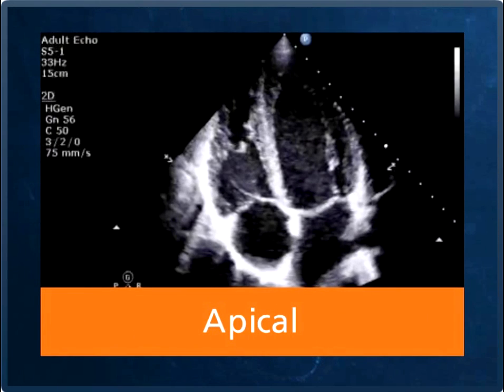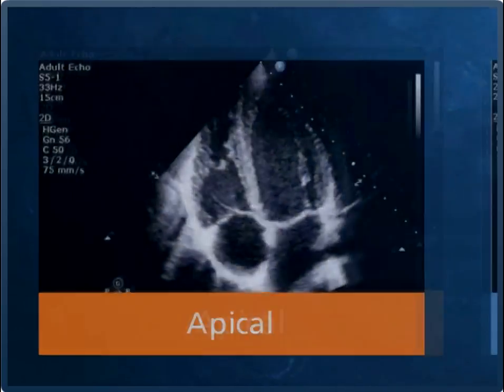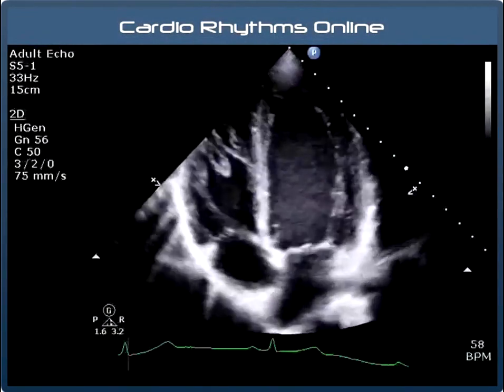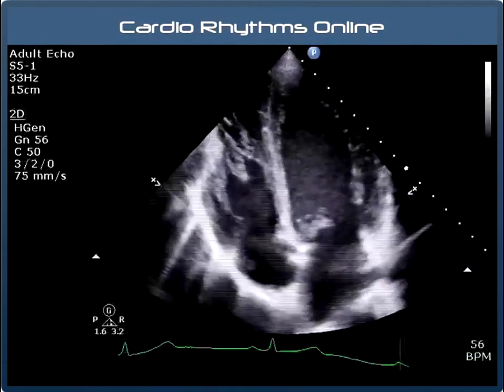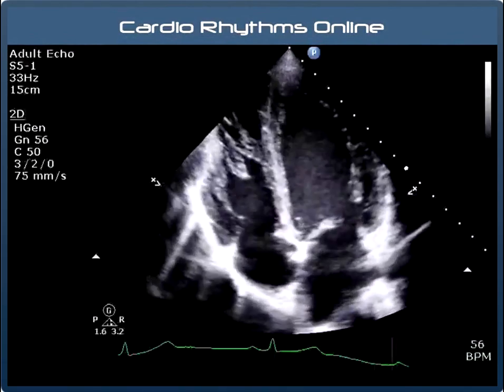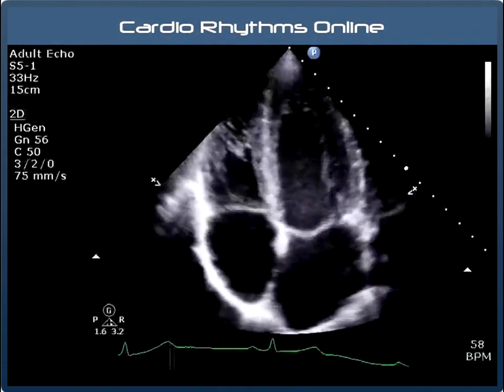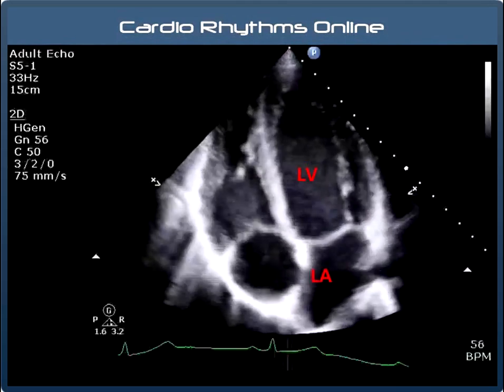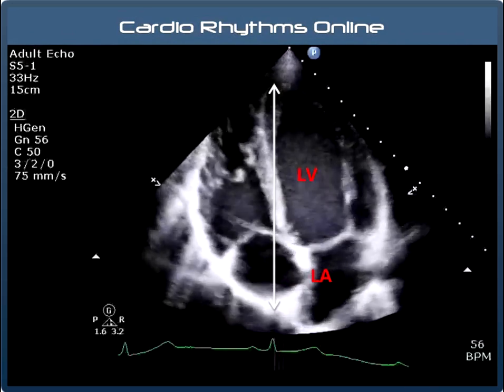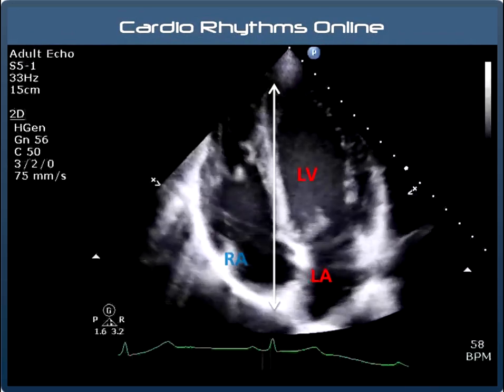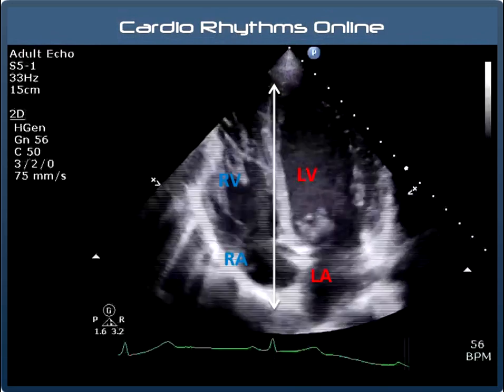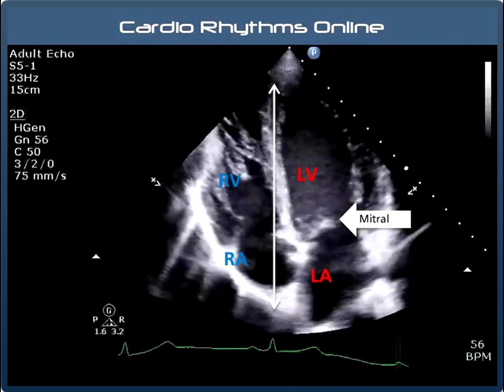Even if your knowledge only runs to the heart has four chambers, this view is very easy to understand. The transducer sits roughly around the V4, V5 chest position. In a normal subject the left ventricle will be the larger chamber, so it shouldn't be too hard to identify. Here it is. This then is the left atrium, here we have the septum, then of course the right atrium and right ventricle. The two valves we see in this view are the mitral valve and the tricuspid valve.